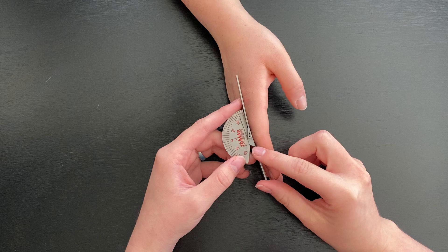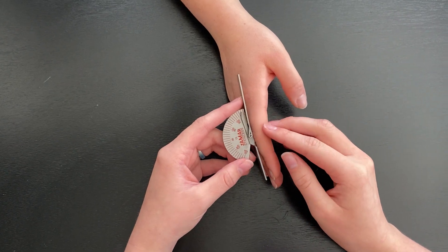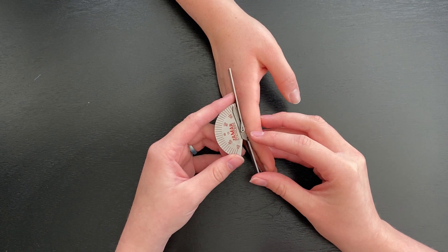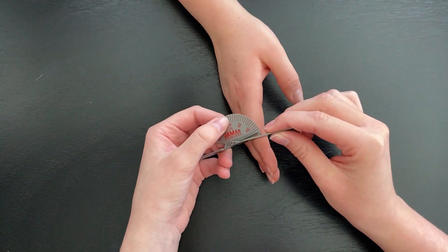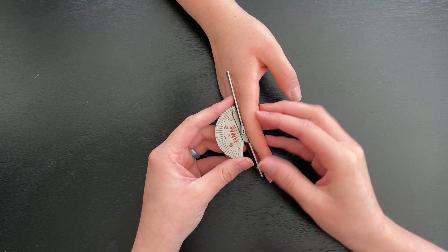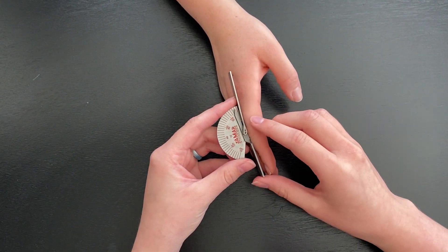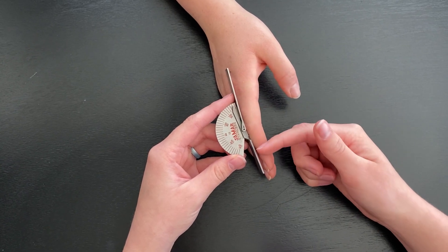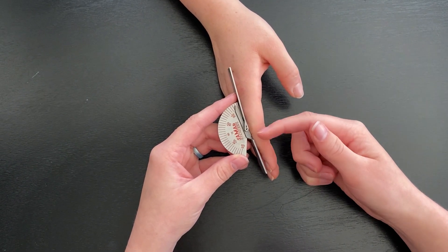The axis placement of the goniometer is going to be on the dorsal side of the PIP joint. The goniometer will start open and each line equals 5 degrees. The stationary arm will be on the dorsal side, midline to their finger and proximal from the PIP joint. The movable arm will be midline on the dorsal side, distal to the PIP joint.